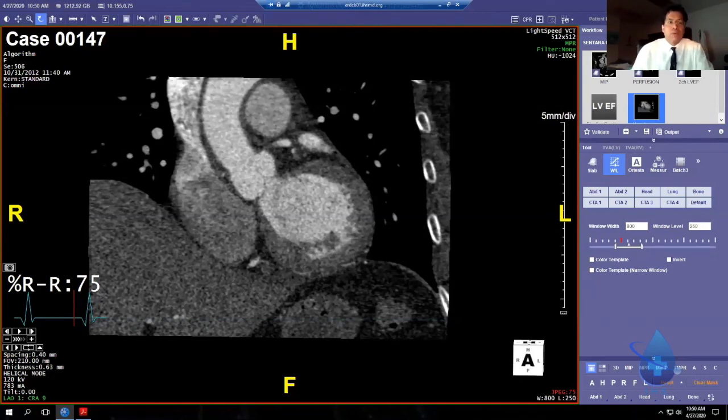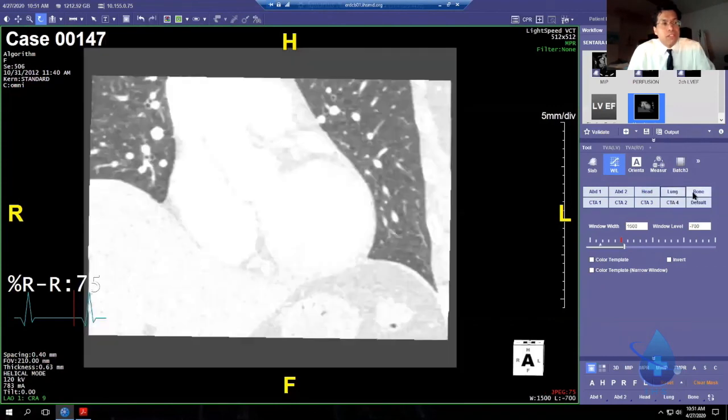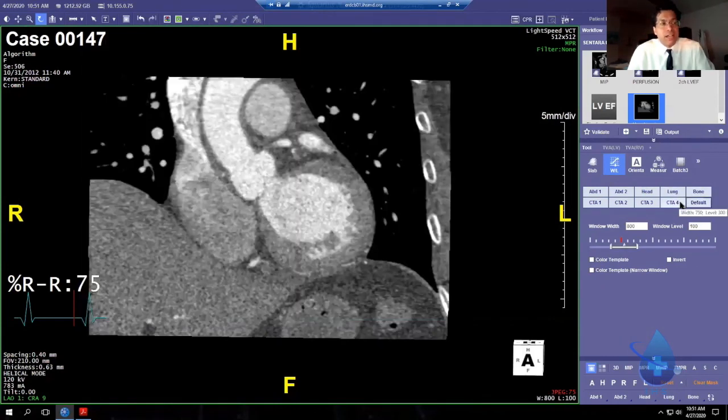So as a result, we have a problem if we want to create a CT modality that can calculate the density of several thousand units, but our eyes can only discern 40 at a time. Okay, so how do I display on a CT scanner lots of encoded values for you? There's only one way to do it, and that is to produce on the screen various presets that scroll through that will display various densities on the scale, on the Hounsfield scale.